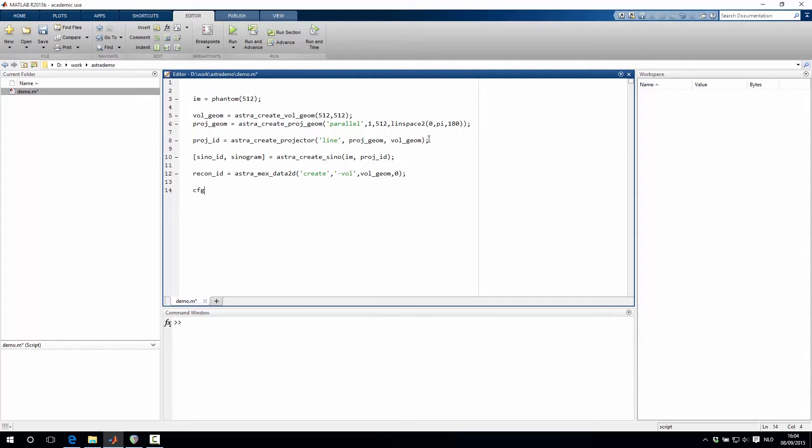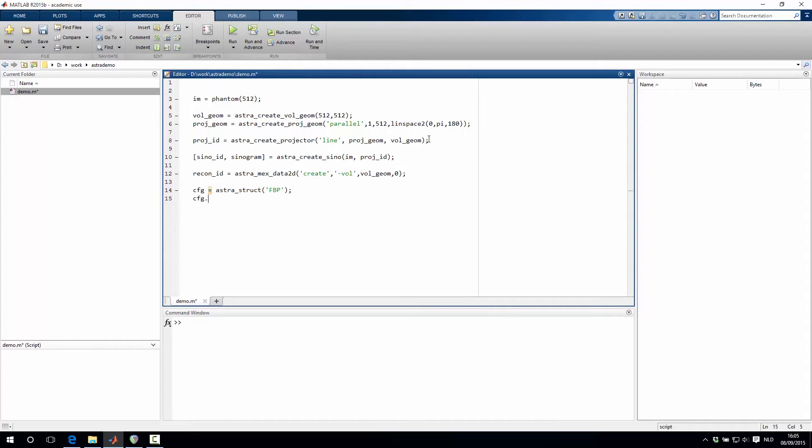So the next step is then to configure the algorithm, which we do by creating an astra structure and specifying that we want to have a filtered back projection. Then we have to add some options. First and foremost, we have the projector ID, where we specify the identifier of the projector.